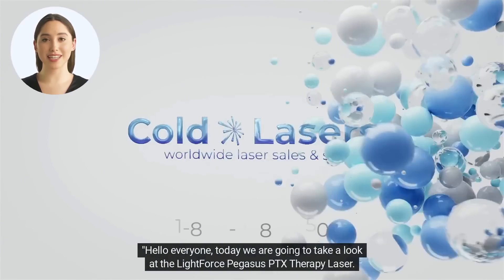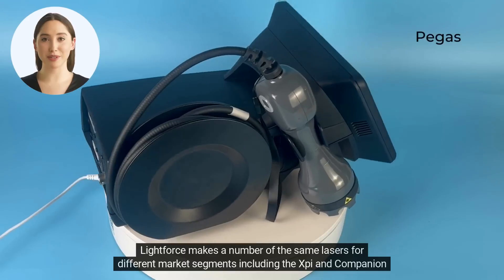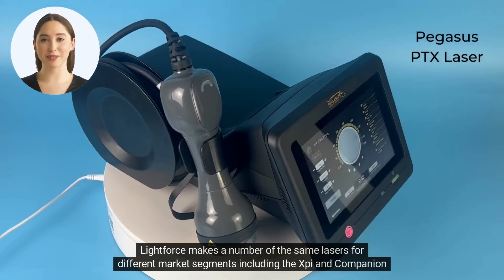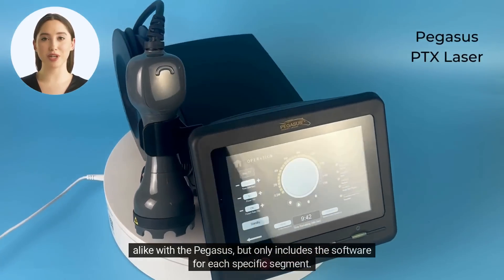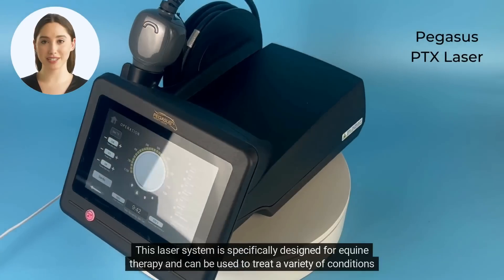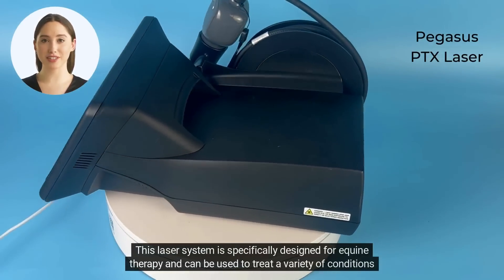Hello everyone, today we are going to take a look at the LightForce Pegasus PTX Therapy Laser. LightForce makes a number of the same lasers for different market segments, including the XPi and Companion alike with the Pegasus, but only includes the software for each specific segment. This laser system is specifically designed for equine therapy and can be used to treat a variety of conditions in horses.